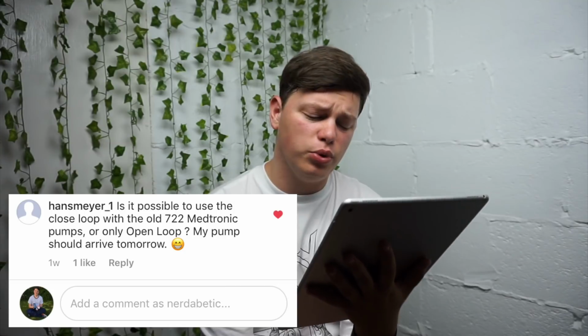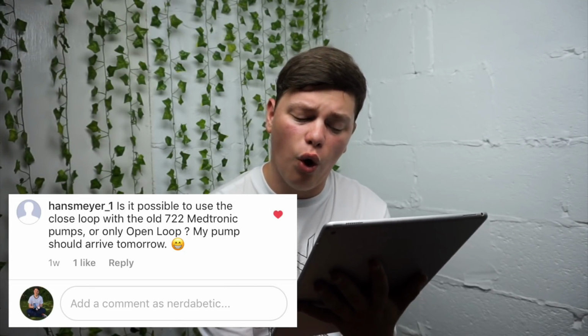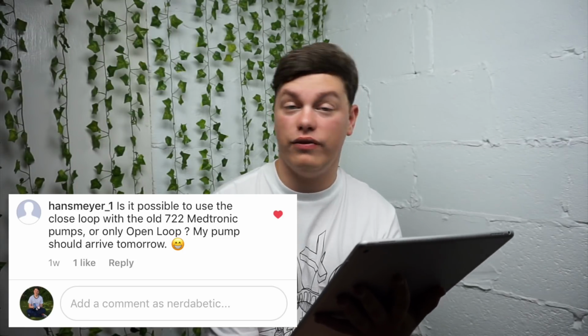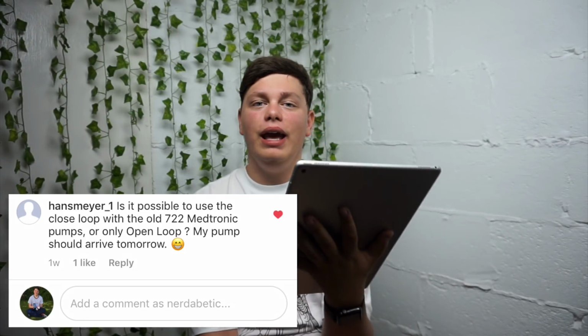Next question: is it possible to use closed loop with an old 722 Medtronic pump, or only open loop? My pump should arrive tomorrow. Great news. Yes, and you can use both, although please make sure on the website that your pump is actually compatible.